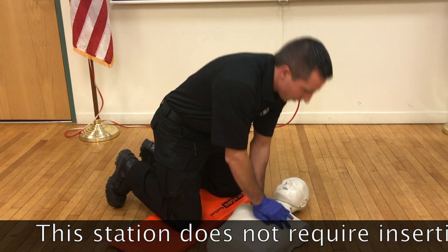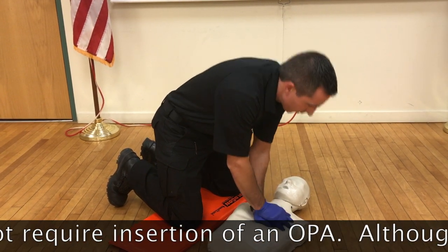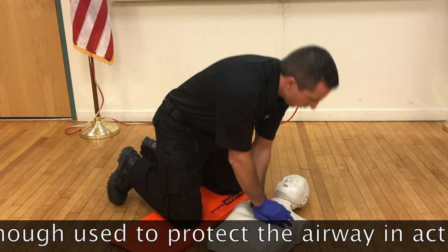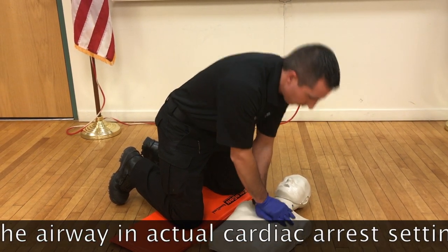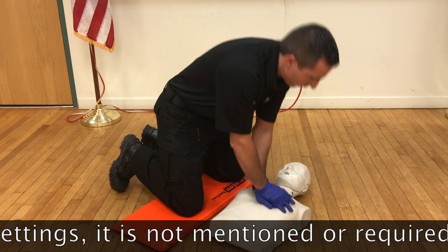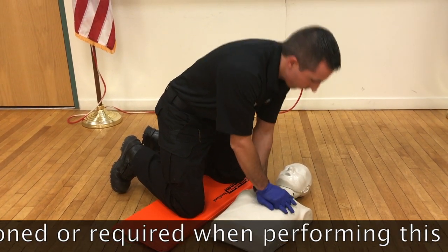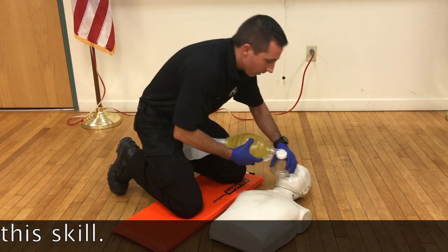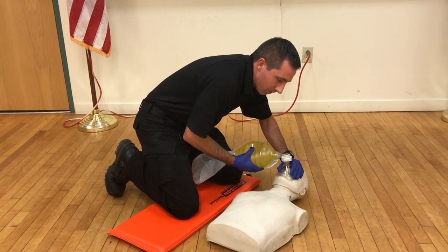Second cycle of compressions: 1, 2, 3, 4, 5, 6, 7, 8, 9, 10, 12, 13, 14, 15, 16, 17, 18, 19, 20, 21, 22, 23, 24, 25, 26, 27, 28, 29, 30. We open the airway, give two breaths.